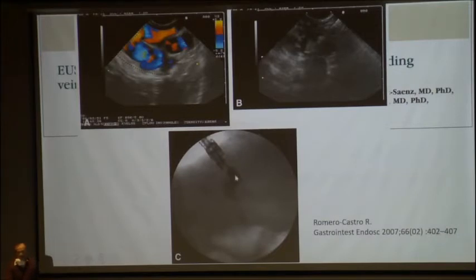If the glue is mixed with Lipiodol, we can also see it under fluoroscopy guidance. But even those expert endoscopists acknowledged that it was quite difficult to see the afferent and efferent vessels, because if glue is inadvertently injected into the efferent vessels, it can also lead to systemic embolism. With 10 months of follow-up in this study, no recurrence of bleeding was seen in these 5 patients.